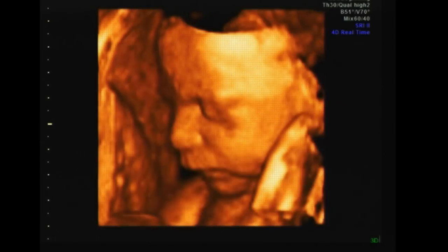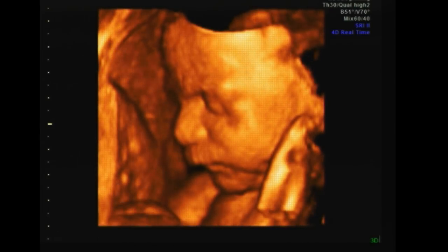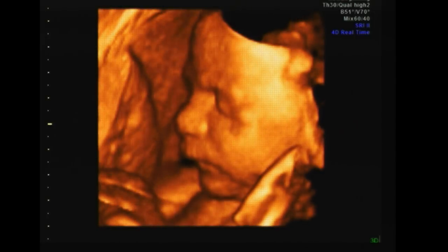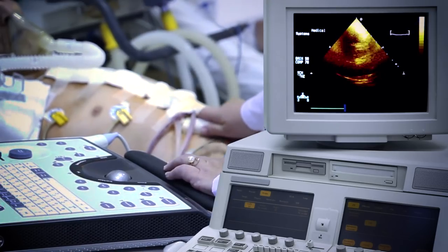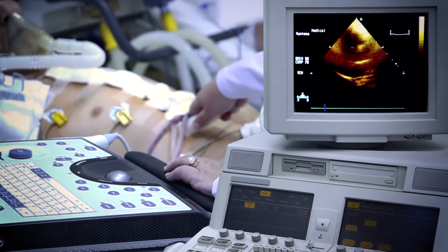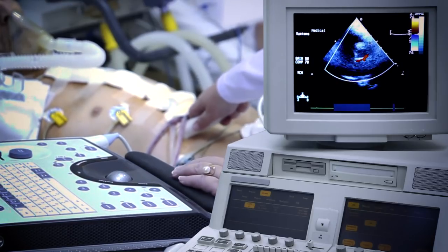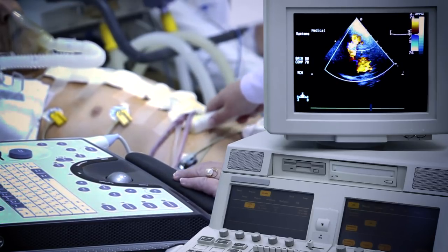However, like many new technologies, there is a complexity and cost to 3D ultrasound. Because ultrasound relies on tiny, low-volume echoes, these imaging devices can require thousands of sensors to generate a detailed picture.